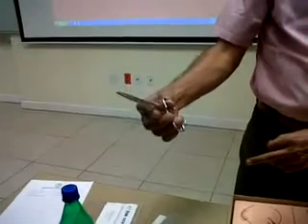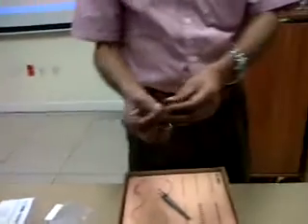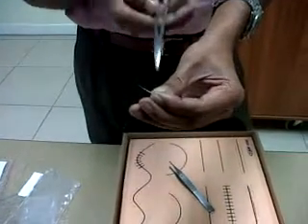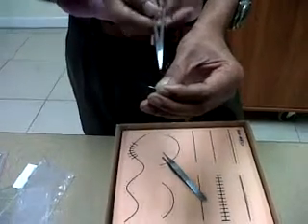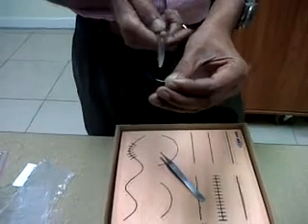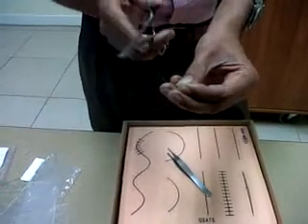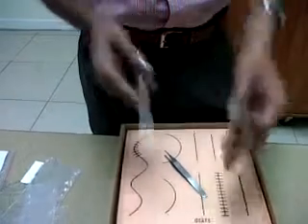Depending on how tight a grip we want. Coming to the needles used for suturing, broadly there are two types: a round-bodied needle and a cutting needle, depending on the cross-sectional appearance. For tough structures like skin, rectus sheath, and linea alba, we use the cutting needle, while for delicate structures like peritoneum, mesentery, and intestine, we use the round body.